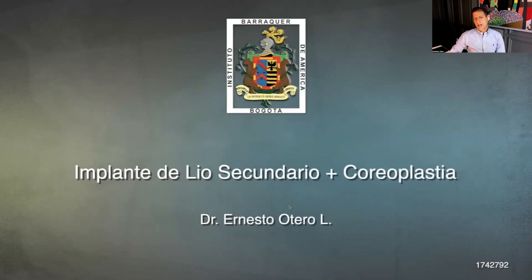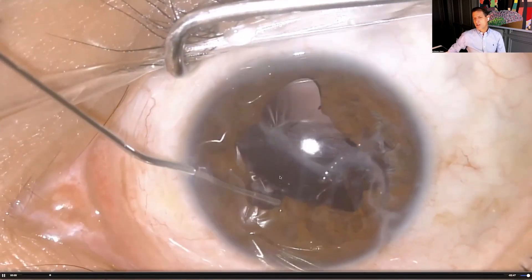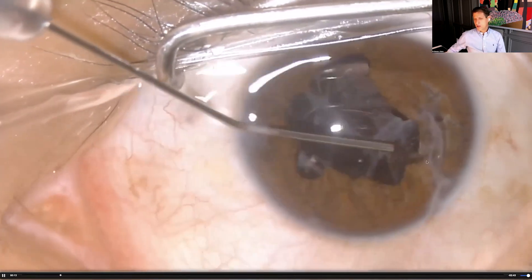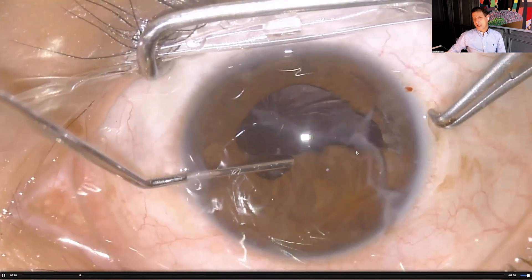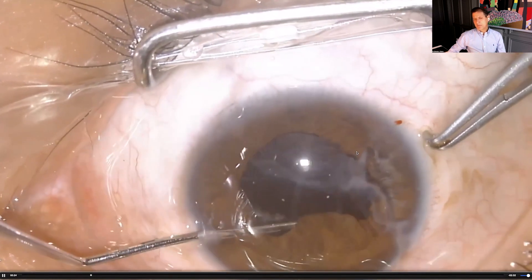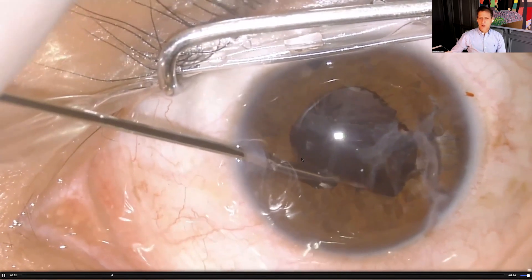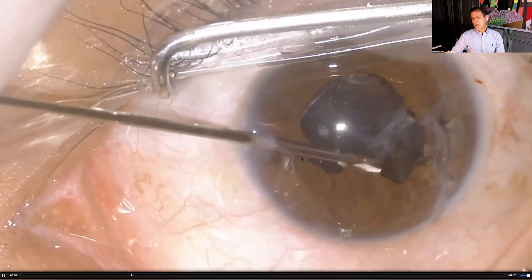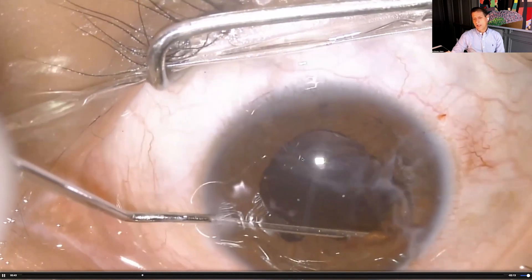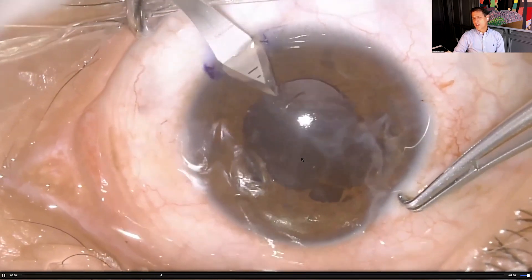When we examine a patient and find a capsule remnant — as in a patient who had ocular trauma with the lens aspirated — the best option is to implant the secondary IOL within the capsule remnant. This patient has a clear central cornea, a good capsule remnant, and posterior synechiae. First we need to remove those posterior synechiae, and it's important to go not only along the pupil margin but also behind the iris, because synechiae form in the mid-iris as well.